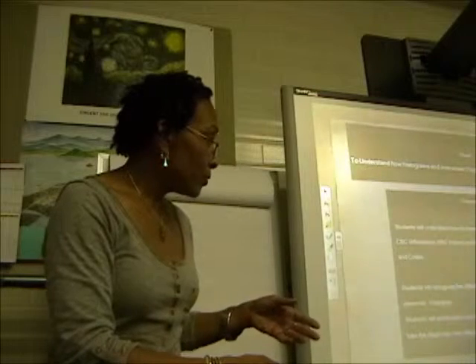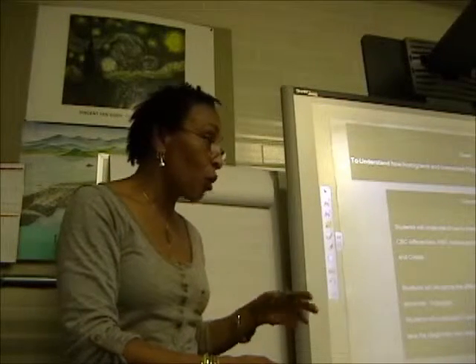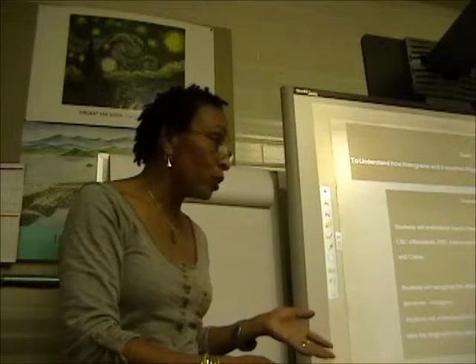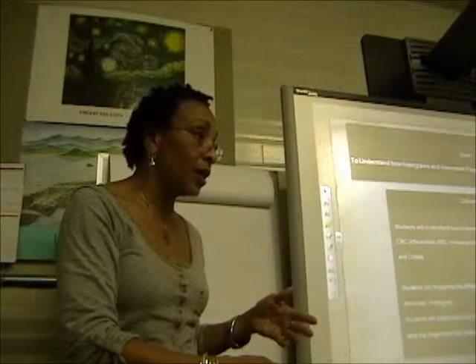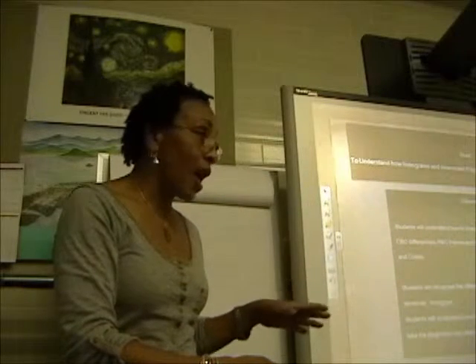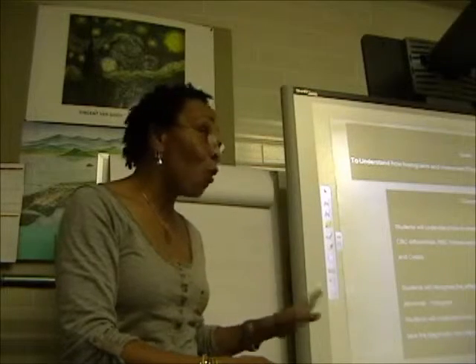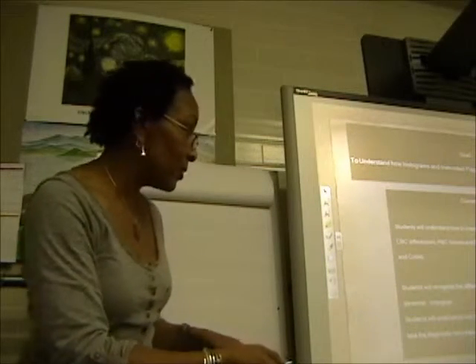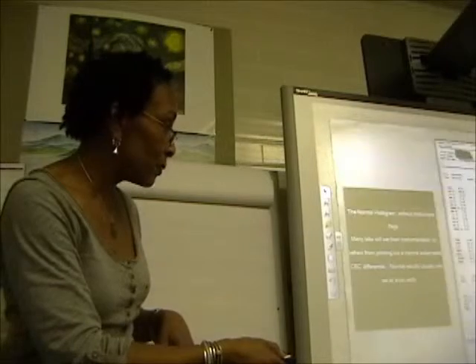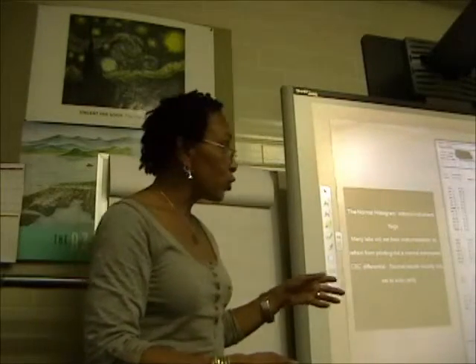And so the outcomes are that you'll understand what a normal instrument report looks like as opposed to an abnormal one, and the flags and the codes that will be on those abnormal histograms and instrument reports. This right here is a normal instrument report.